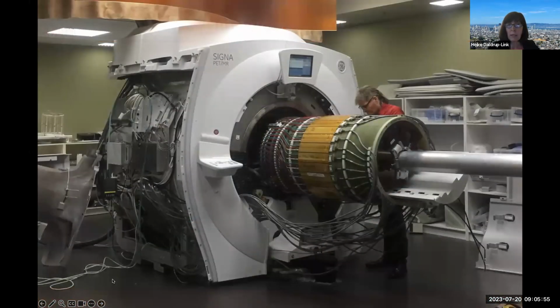So here's one way you can achieve that, and that is by using a PET MRI scanner. This here is our PET MRI scanner while it's under maintenance. You see that this is a wide bore MRI scanner with an inner diameter of 70 centimeters. The usual MRI scanner has an inner diameter of 60 centimeters, so this here is wider.